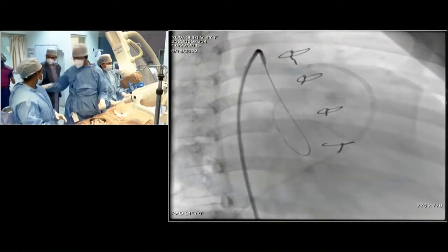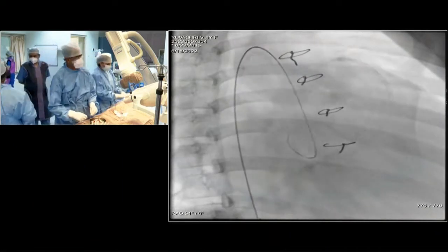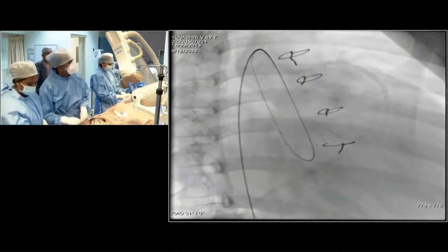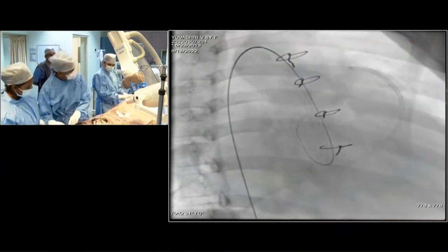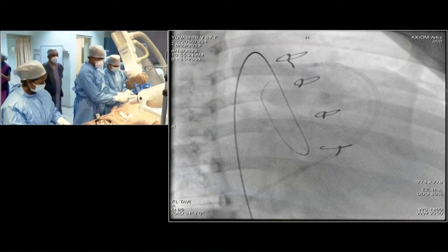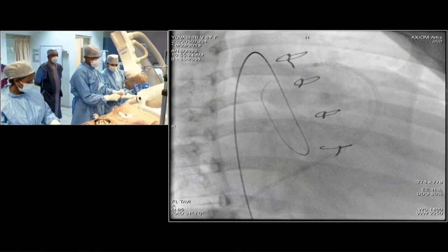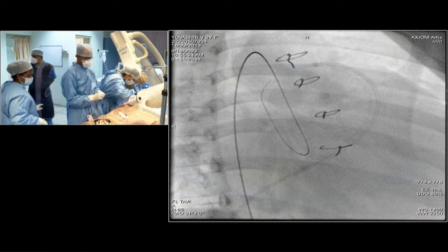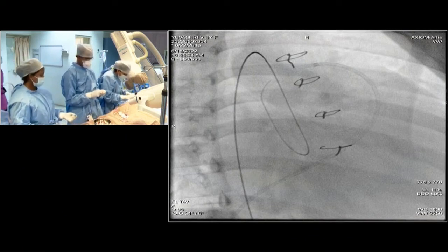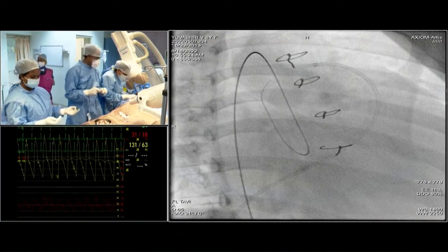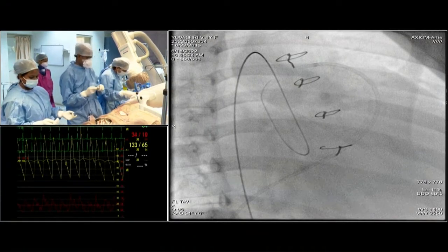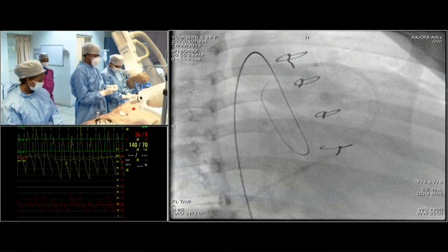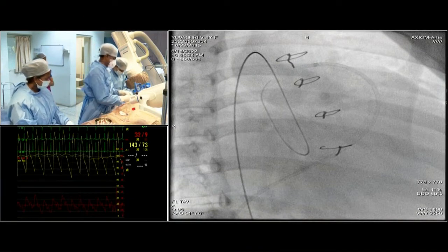The ADO1 is generally one of the best devices for RSOV closure. You can also use the ADO2 if it is too small, or a muscular VSD device. For NCC-to-RA fistulas, it is one of the easiest to deal with — you can snare from the SVC or IVC, and the ADO1 device sits very nicely. This procedure doesn't take much time.